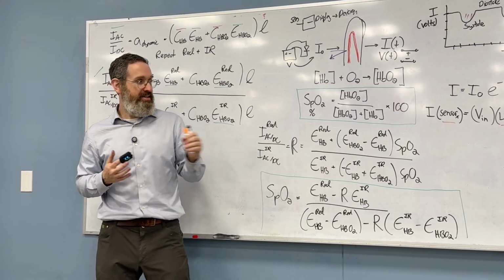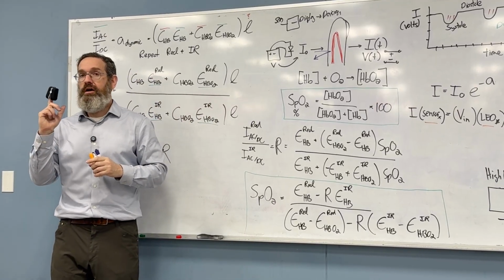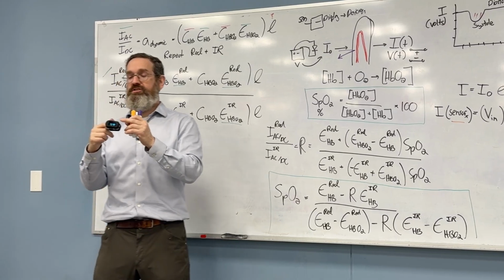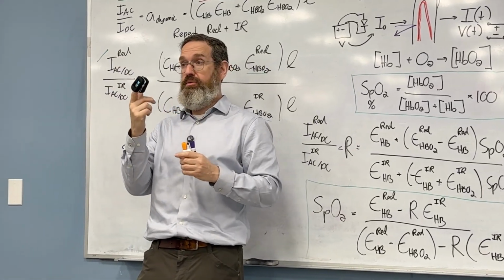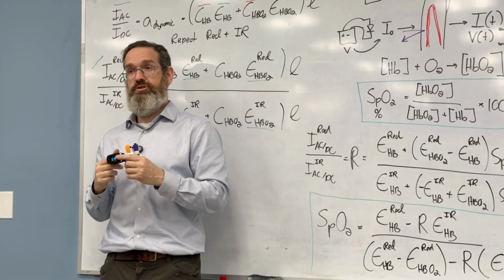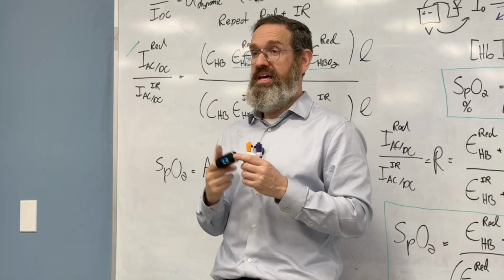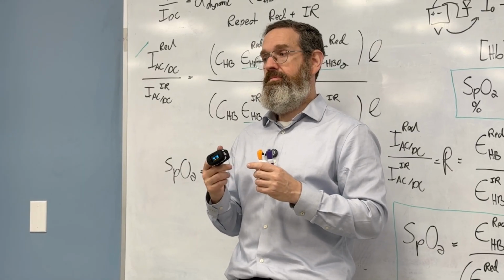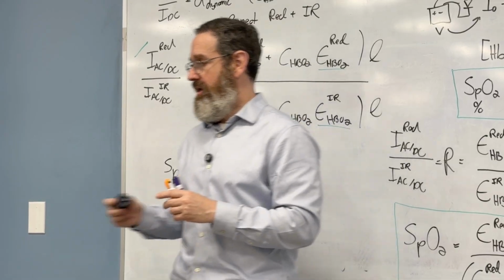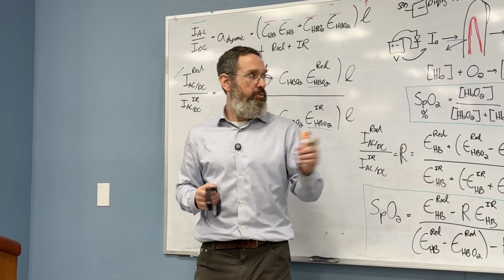See what I'm saying? And so that's why I wanted to go through this math. I wanted to show you this. There's not a lot of things like it. I mean, one reason you could say that the first thing Adrian does when he pulls up in an ambulance is put this on people is because it's very useful, which is true. But the other explanation for why Adrian puts this on people is he doesn't have anything else. Put it another way, we're going to talk about how to measure blood glucose, right? You could say, oh, that's cute.